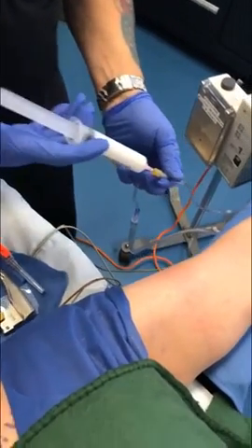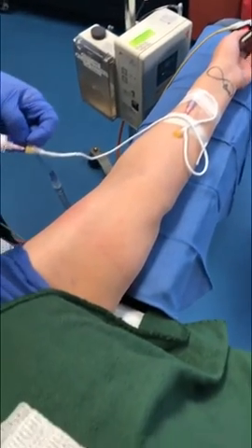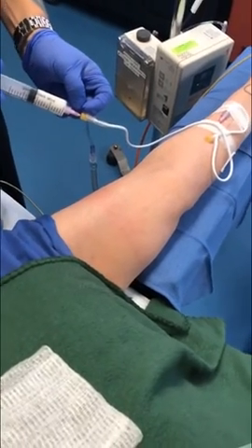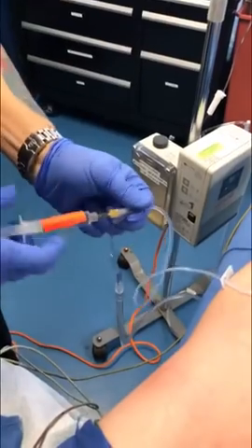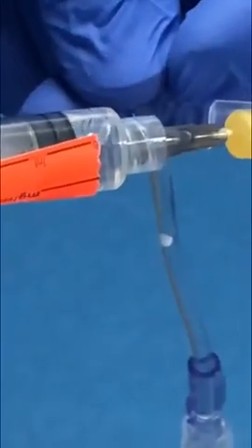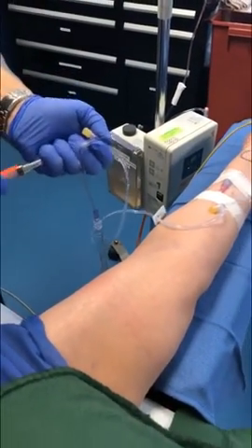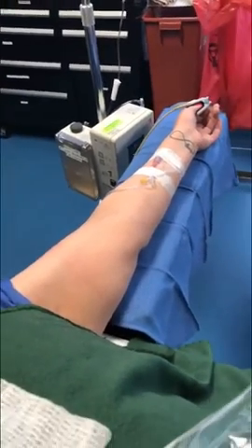All right, so it's go time. Here we go. Got some go juice here — about 160 milligrams of propofol, 50 milligrams of lidocaine. You're going to feel a warm sensation going up your arm and a funny taste in your mouth. Big deep breaths. Patient is fully asleep. I'm going to give her 50 milligrams of Zemuron, a neuromuscular blocking agent — and you guys already know that it's a non-depolarizing agent.